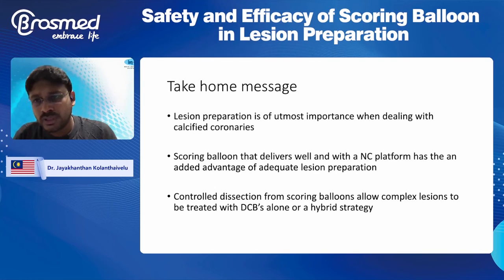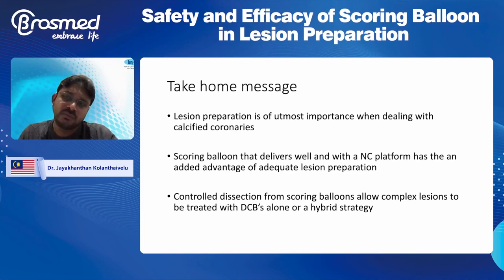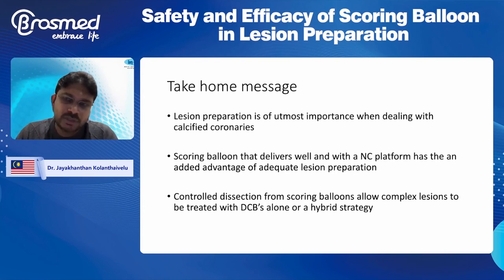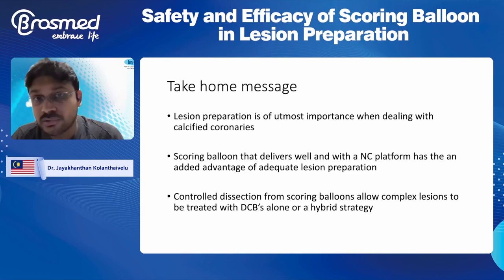And also with the scoring balloon, supposedly they're bulky, but in this NC wedge, especially, when your crossing profile is pretty good, you're able to deliver it, and you're able to prepare the lesion adequately to be able to deliver whatever devices, stents or balloons that you want to deliver. And scoring balloon also gives this added advantage of a controlled dissection, especially for those who are believers of drug-coated balloons, or those who treat very diffuse lesions and use a hybrid sort of strategy. So I just tried to put forward three scenarios showing how I use scoring balloons, at least, as examples.